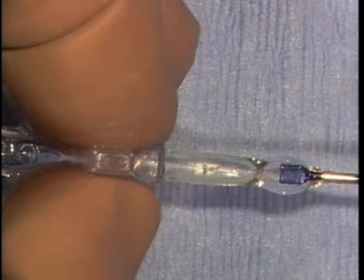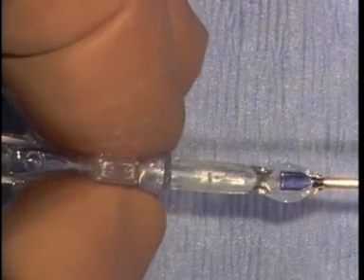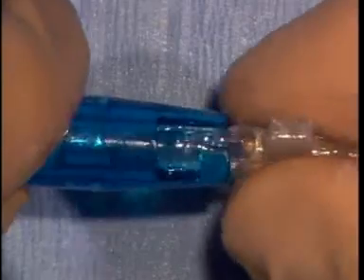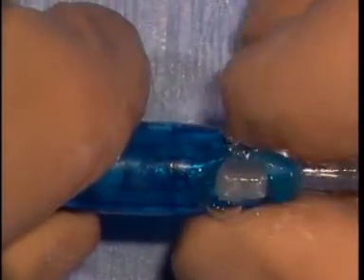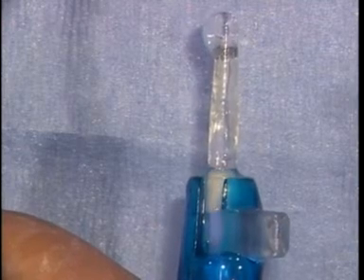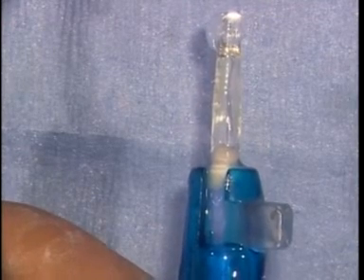Continue this process until the ICL is positioned within the cartridge so that its leading edge is adjacent to the end of the cartridge. Release the ICL and remove the forceps. Slide the cartridge into the front of the injector and snap lock the vertical tab into position. Advance the plunger until it is in contact with the lens. The final lens position should be within approximately 2 millimeters of the end of the cartridge.